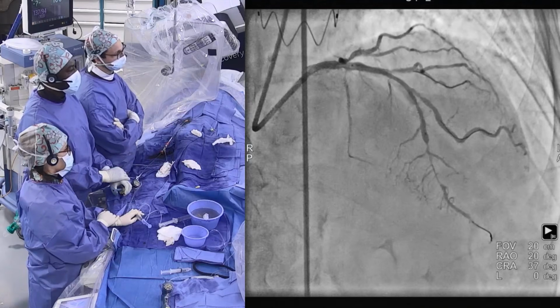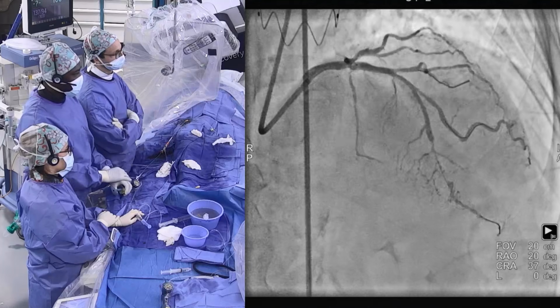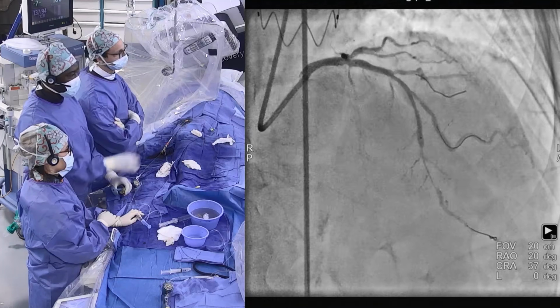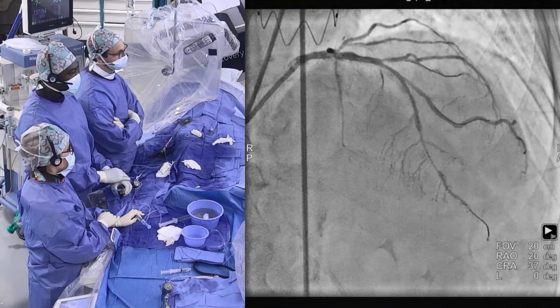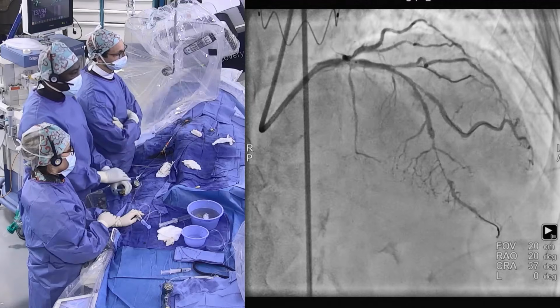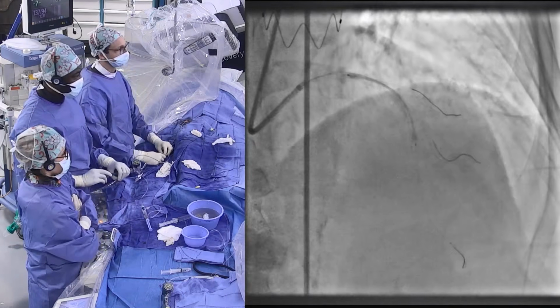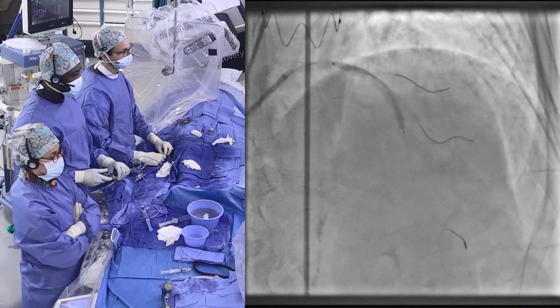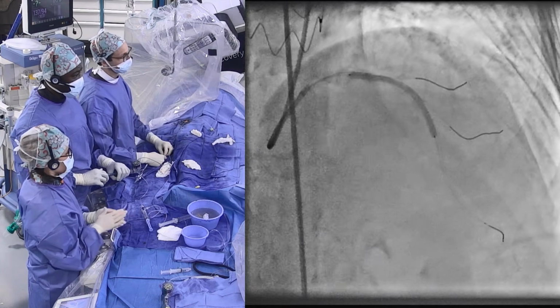But if we focus on the lesion in the area of interest, first of all, the diameter and the length of the stent are okay. 48 is going to cover everything according to the IVUS guidance. So we are in the disease-free landing zone distally, and maybe we can expand here to start with. It's a 30 by 48, and I will go very gradually. As it is quite a long stent, we will have to wait to have a nice expansion.